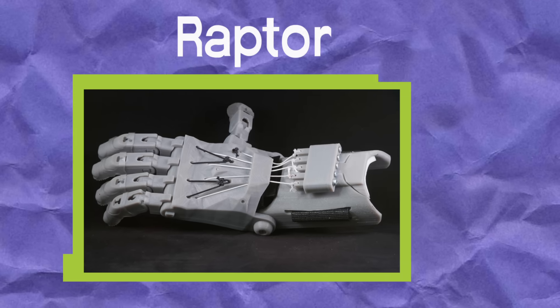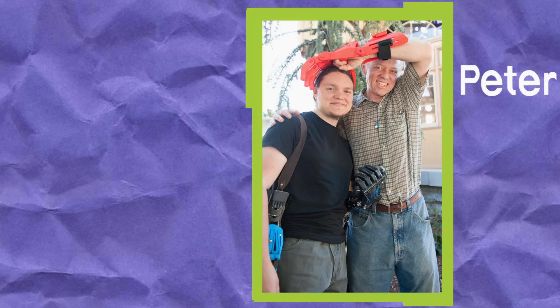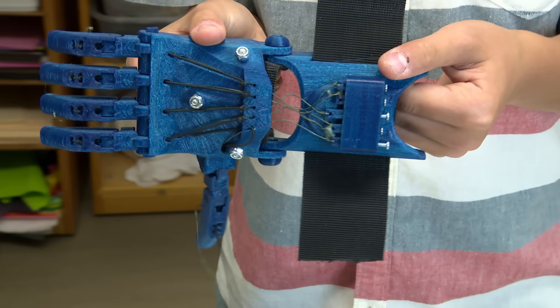So we're going to build a new 3D printed hand for Max so that it's easier to use. It's called the Raptor. The hand designer, Peter Binkley, created it and named it after his son, Peregrine, also a type of bird. This is the Raptor. Fist bump. Boom.